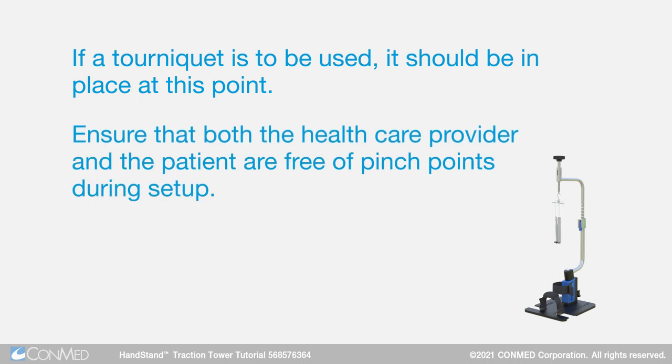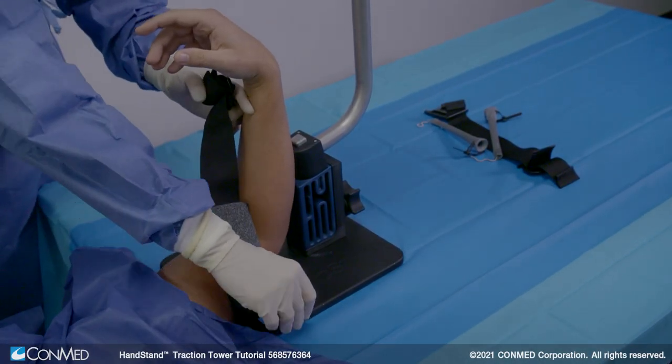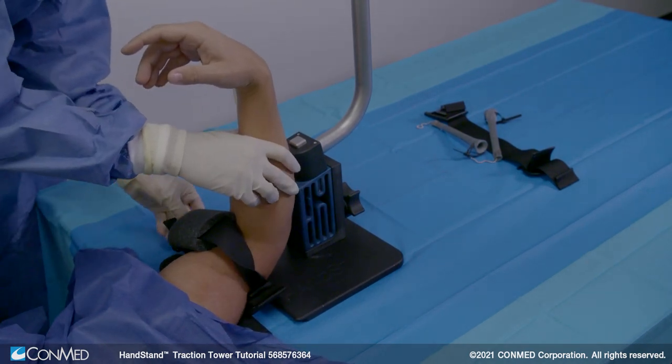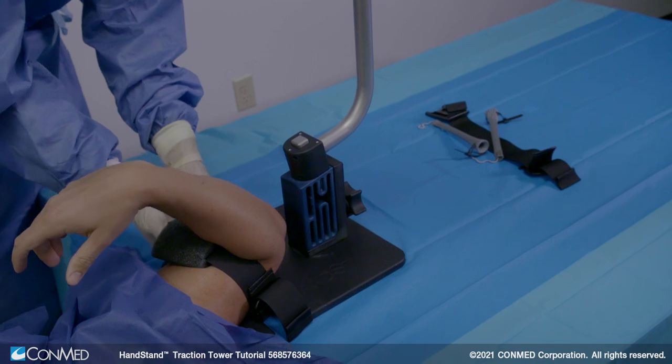Ensure that both the healthcare provider and the patient are free of pinch points during setup. To secure the patient's upper arm to the handstand tower, place the buckles of the bicep strap in the channels on the base plate until they're next to either side of the patient's arm. Adjust the strap length until the patient's arm is secured to the base plate.